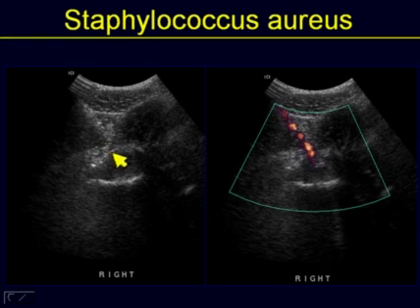And to accentuate that, it is not uncommon for us to apply power Doppler in order to see not only the extent but also the direction of the needle. So with power Doppler, therefore, it helps us to immediately visualize the needle, and not only the shaft of the needle but the very tip of the bevel, in order to be clearly positive that we're within sampling area of the hip.